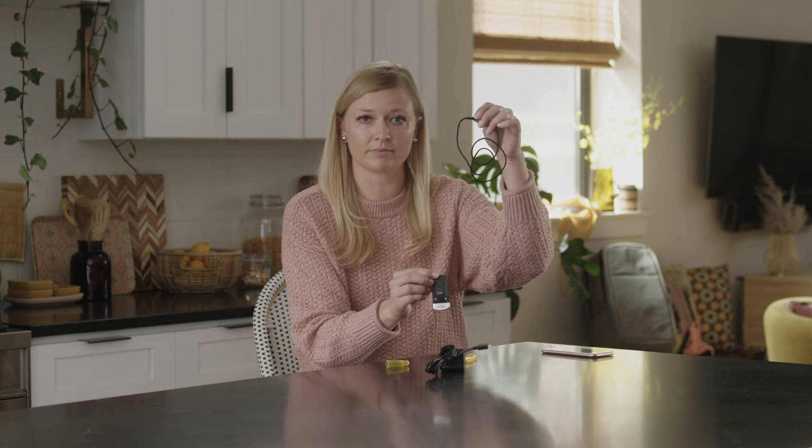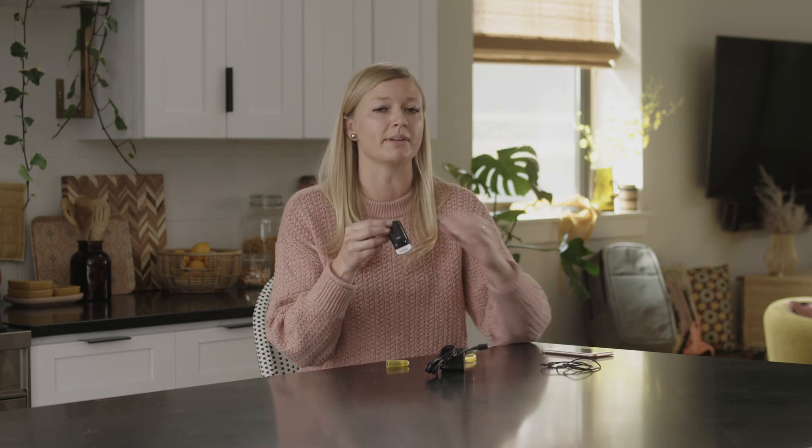Attach the phone clip to the included neck loop, or you can also clip it to your shirt.